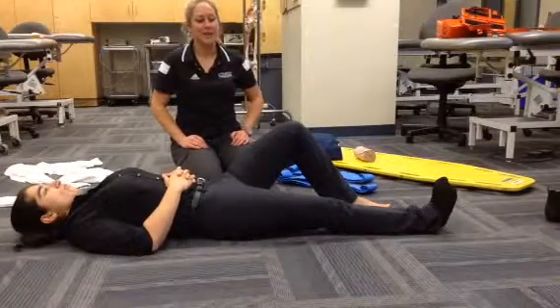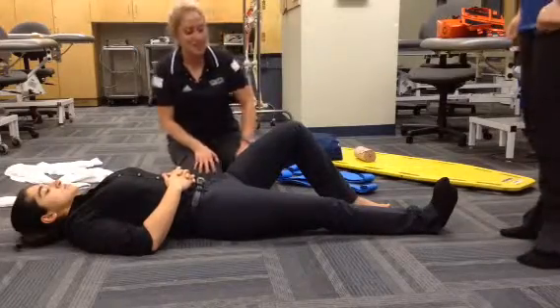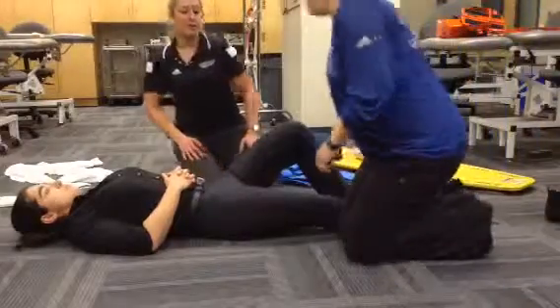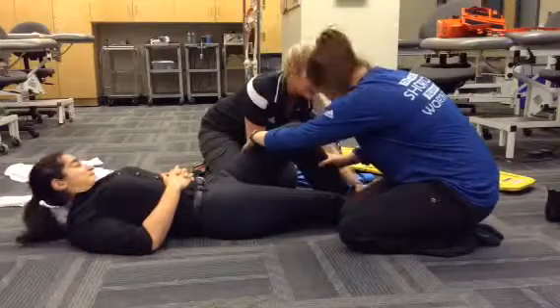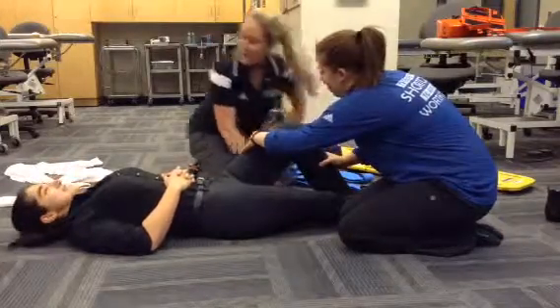This is for a patellar dislocation that we attempted to realign to anatomical position and met with resistance. I'm going to first have my assistant hold the joint stable. I'm going to check PMS. Can you feel me touching you? Can you wiggle your toes for me? Cap refill is good.